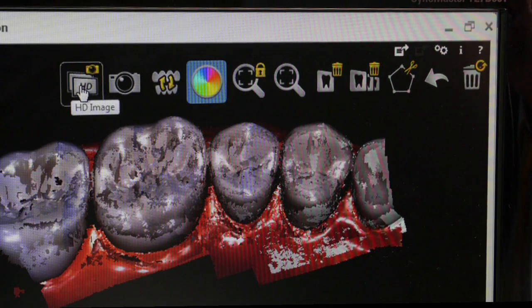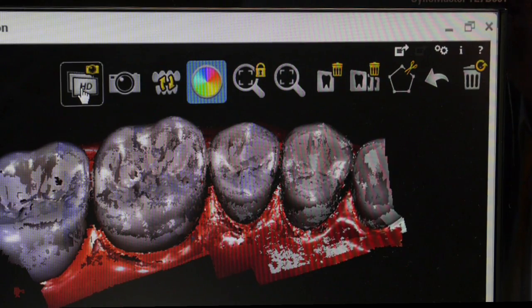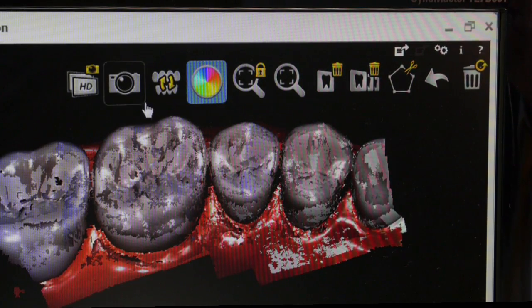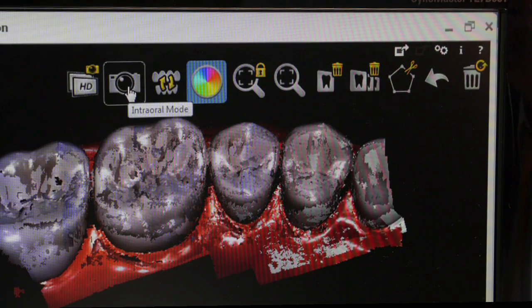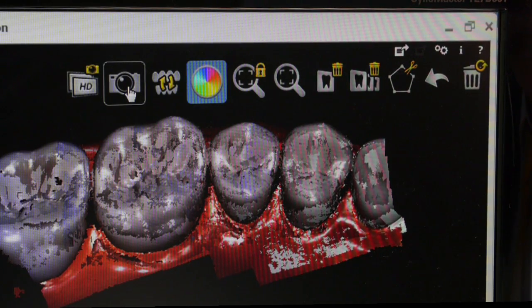This icon that I've hovered over here allows you to click and then capture HD images. The next one here is our 2D intraoral digital camera mode, so you click on this icon and then take 2D photos.